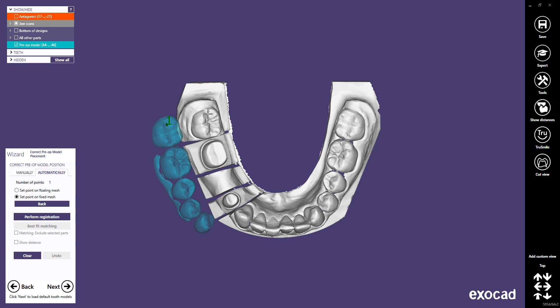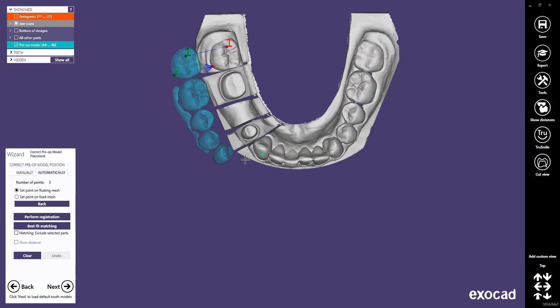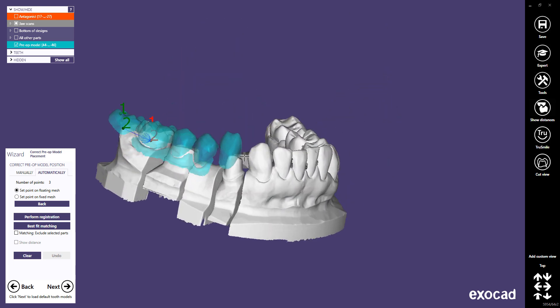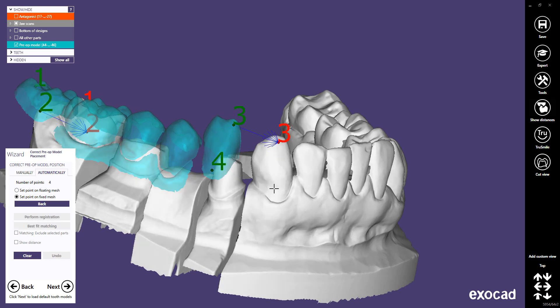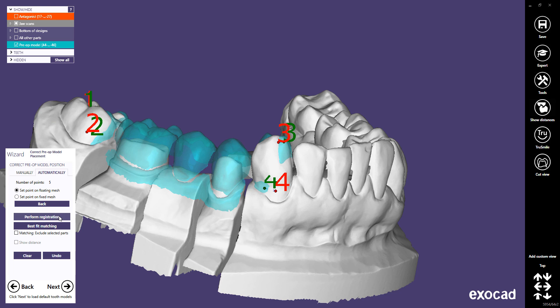Use as many points as you need. Note that the Best Fit Matching feature might not work properly here, as the mirrored pre-op adjacent teeth look completely different from this side's jaw adjacents. The following construction is then performed the classic way — loading tooth models, adapting, and free-forming them.